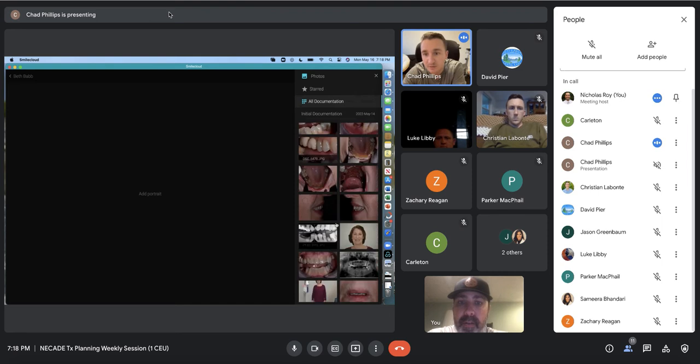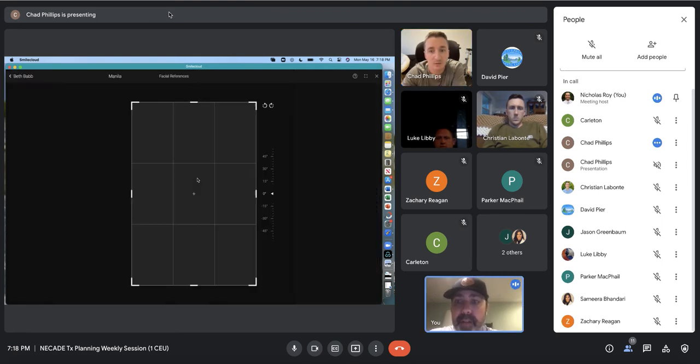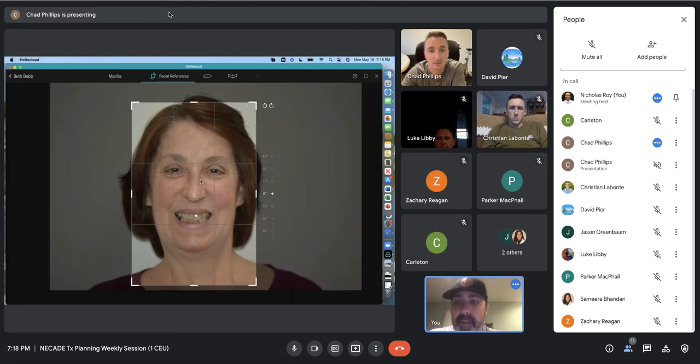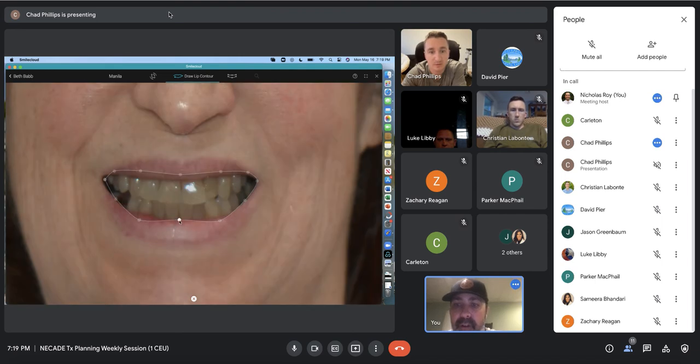Let's go back to... That's really good. That's a really good rendition. Yeah, I guess I can just do this real quick. While you're doing that, pick the photo. Chad, we have software that does this. It's called Preview. I have not been able to get it to look as good as what you just did. And this software is probably superior.